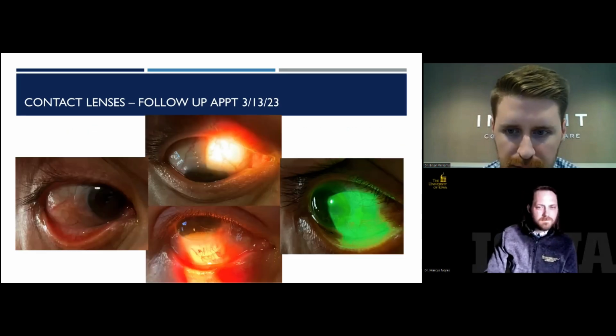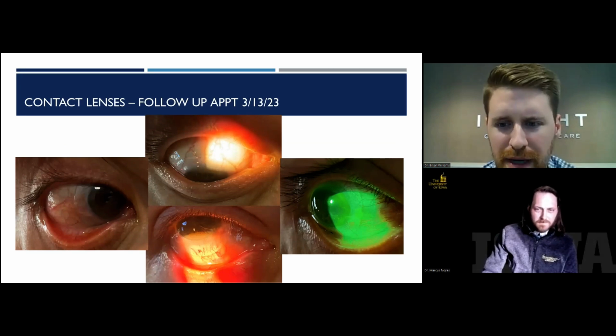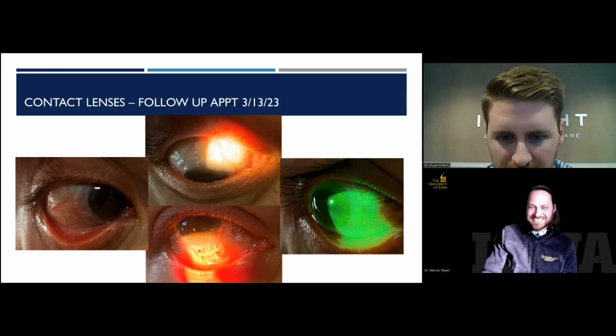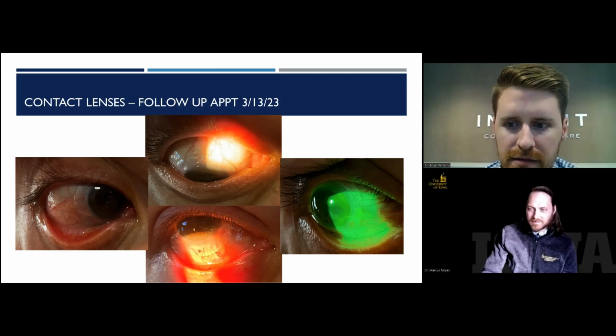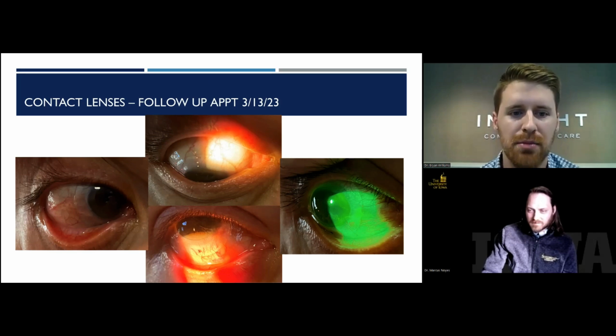So this is up, down, left, right. Probably could have benefited from a pixel here with these pictures, but the biggest area of irregularity was definitely where you see the neon color right over there, where it's really contouring, where looking at it underneath the microscope was far more elevated, far more inflamed. So the Visionary Optics people did a great job mapping that out for sure.